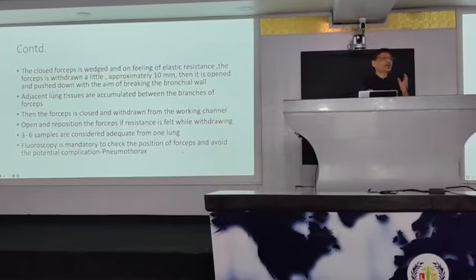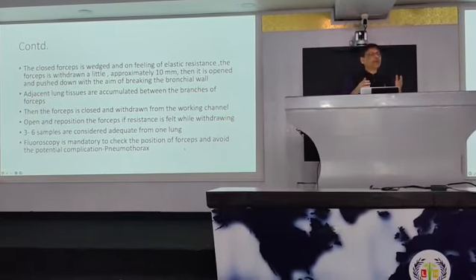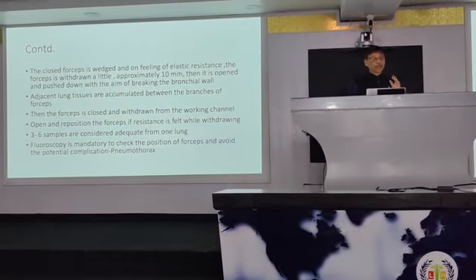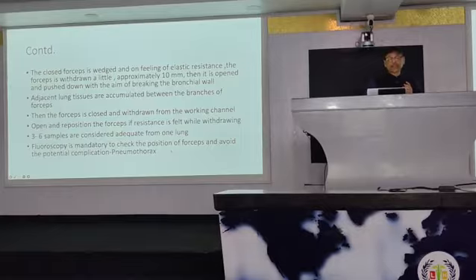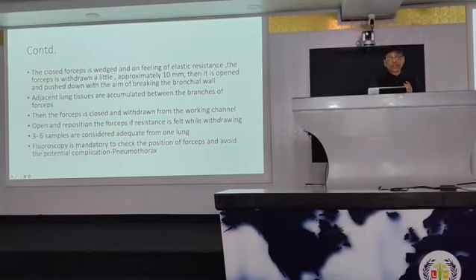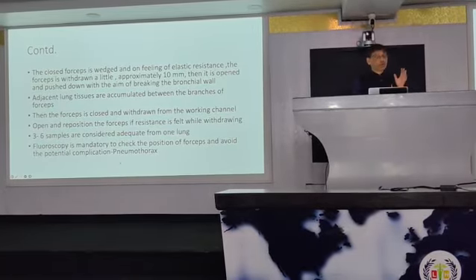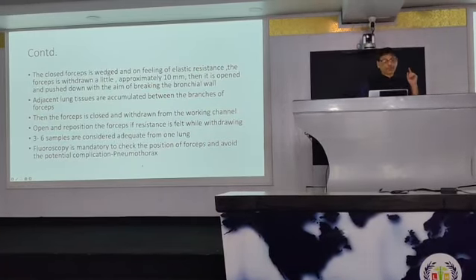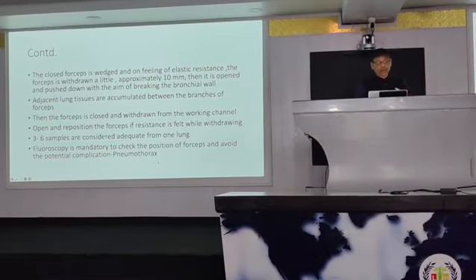Fluoroscopy is a type of X-ray machine, so you can see where your forceps is. Fluoroscopy is mandatory to check the position of forceps and avoid the potential complication of pneumothorax. If fluoroscopy is available, it will be better. You can see where your forceps tip is, so you can avoid the pneumothorax.